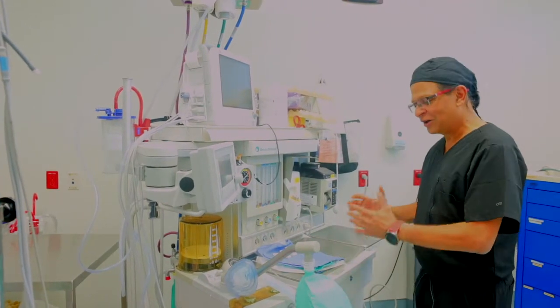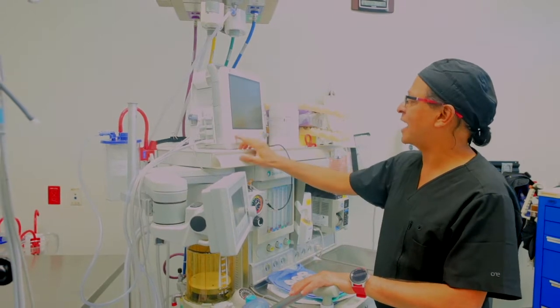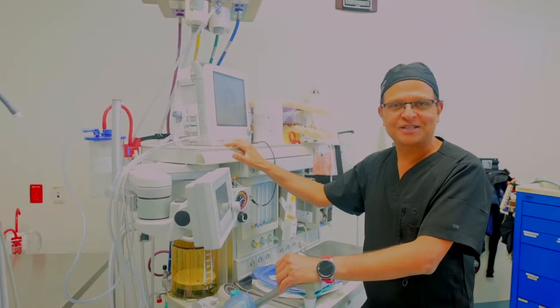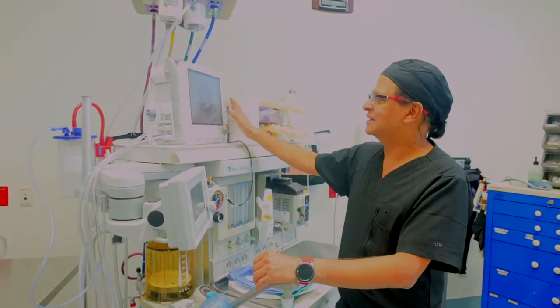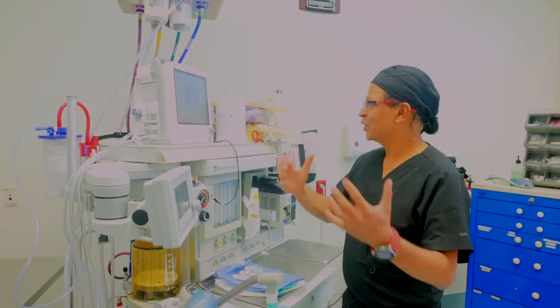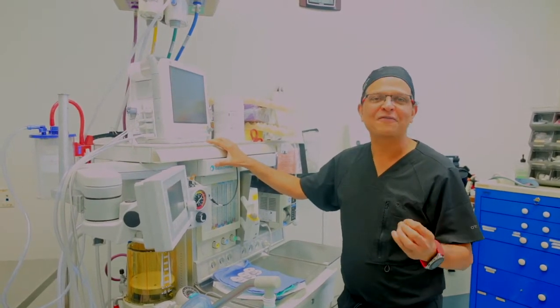Now there is a different component to this machine. What you see is a monitor where we monitor different aspects of the patient's safety parameters, such as blood pressure, EKG, and pulse oximeter. This is like a dashboard to the patient's safety. In other words, this will tell us in real time, minute to minute, what is going on with the patient's vital signs that keeps them safe, alive.